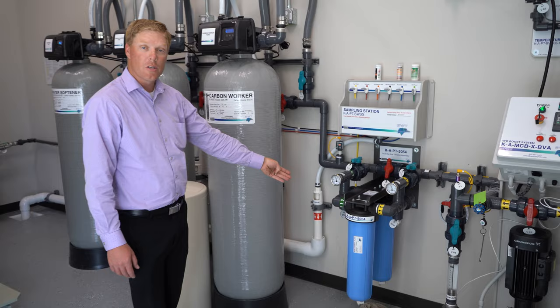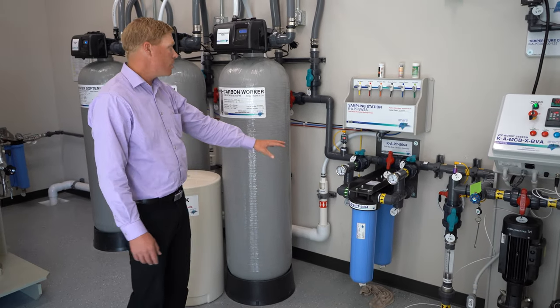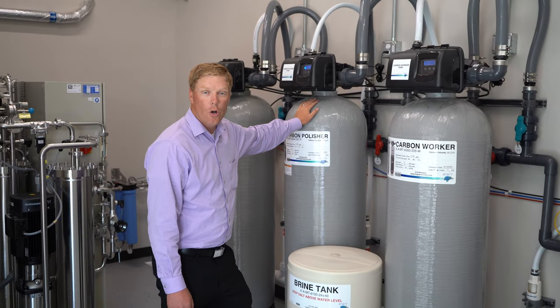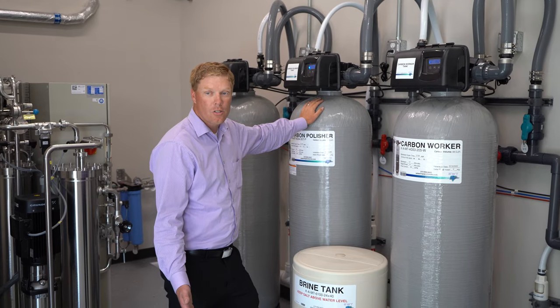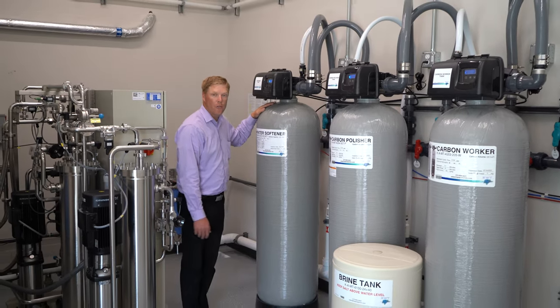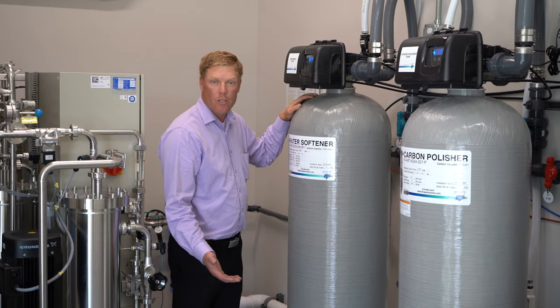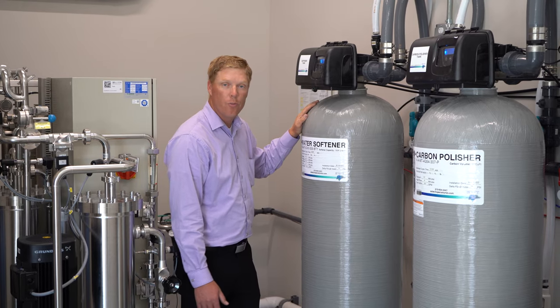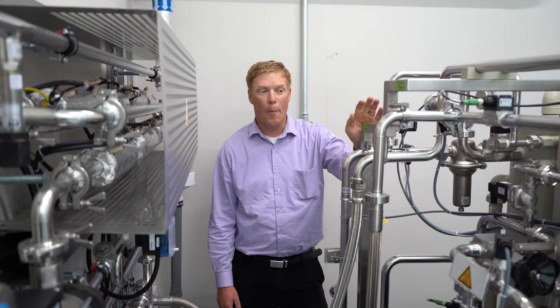It then goes through big blue filters that remove any large particulates in the water. Then it goes through two carbon tanks, which each remove the chlorine and chloramines that the city puts in to make water safe to drink — but those are not safe for dialysis. Then it goes through a water softener to remove the hard minerals in tap water, which also have to be removed for dialysis.